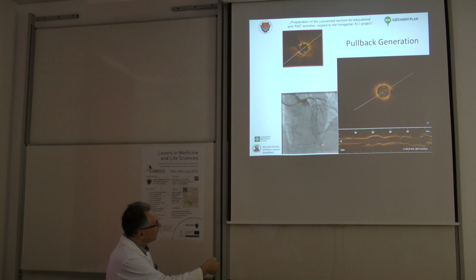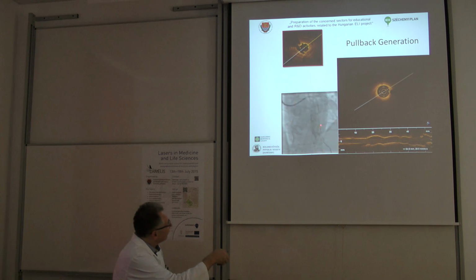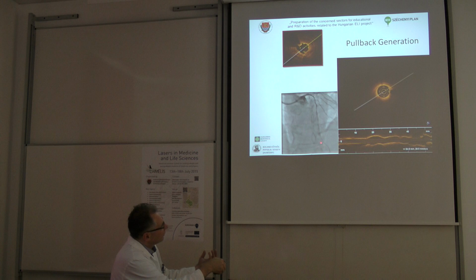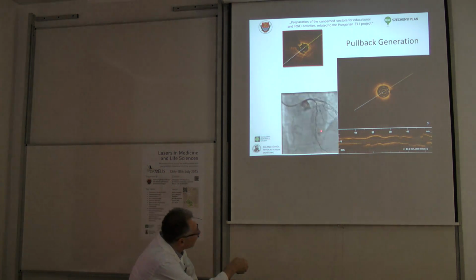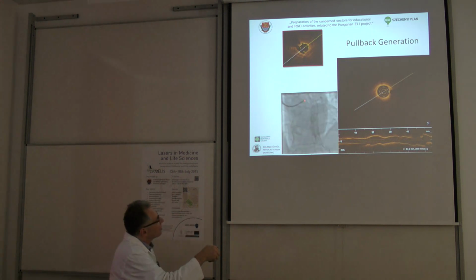Can you see? I can recognize this is a longer one. This is 4.5 centimeters. The part that is bolder is darker. Yes, but this is a continuous wire, 180 centimeters in length, and on the top of this we have the OCT probe, and that's why it's less dark. Yes. The plastic tube in which the OCT probe is spinning and pulled back, you almost cannot distinguish.